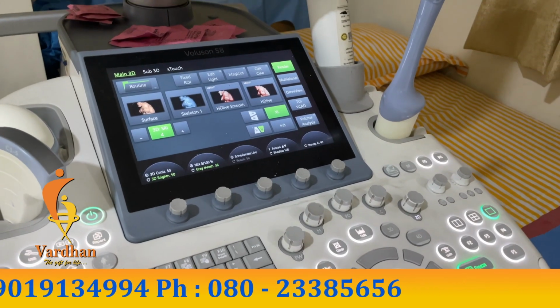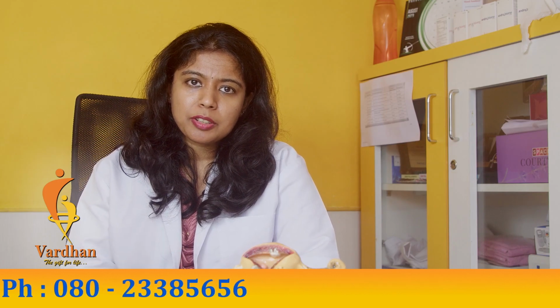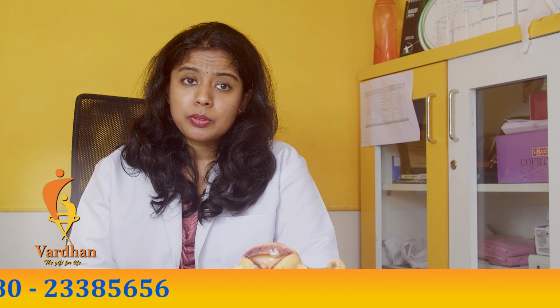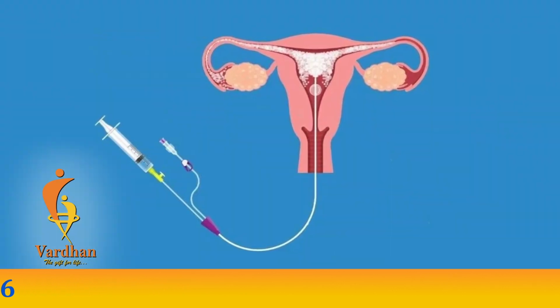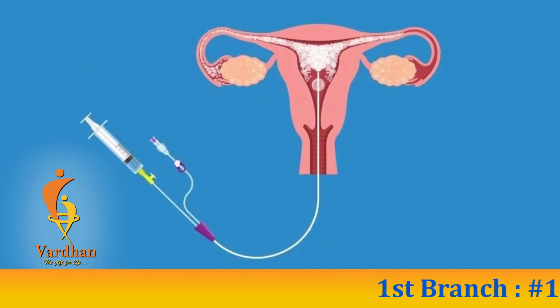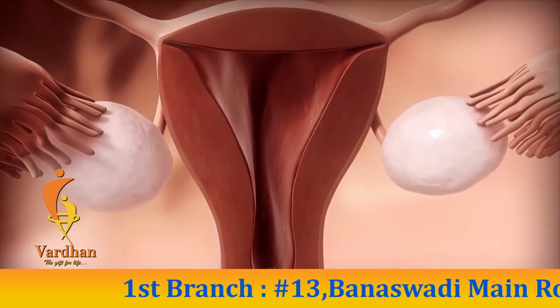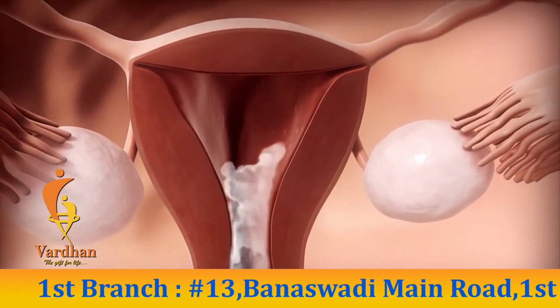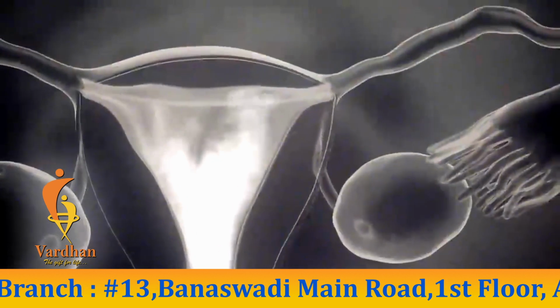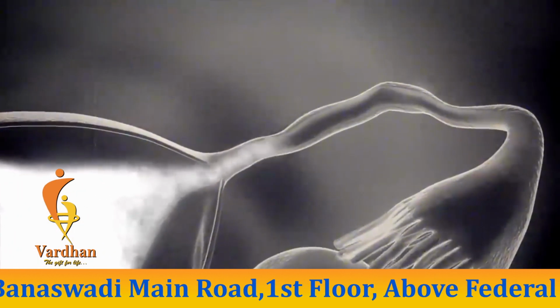During the procedure, just like a vaginal scan, you would be put in a position lying on your back, and then we would use a speculum to visualize your cervix. Then we insert a small plastic cannula or catheter inside your cervix, that is the mouth of the uterus, and the X-ray is positioned on top of your pelvis. Then we inject a radio-opaque dye into the uterus, and we take pictures of the uterus while this dye is being injected.